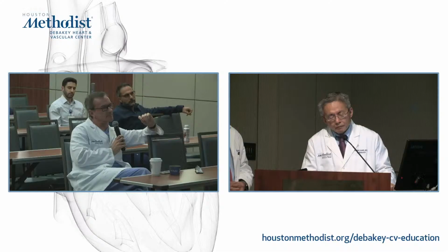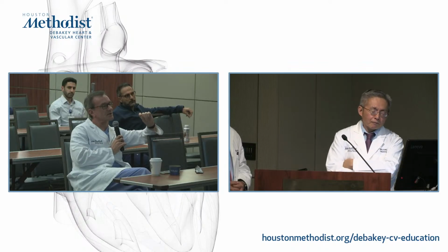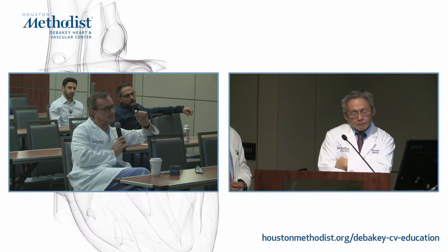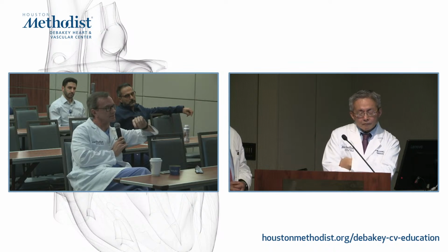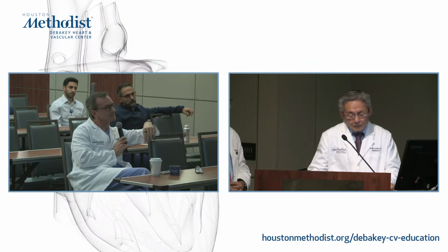The question for you is about pannus. You showed nicely that pannus on the underside, the pressure and flow side of the aortic valve. On the mitral valve, is it on the pressure side, the LV side, or the flow side, the LA side? How does that work on the mitral side?